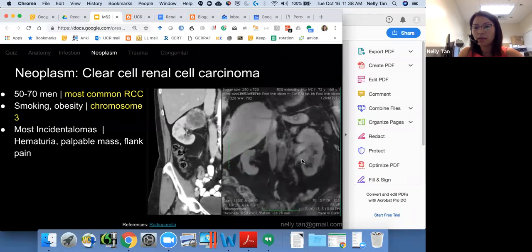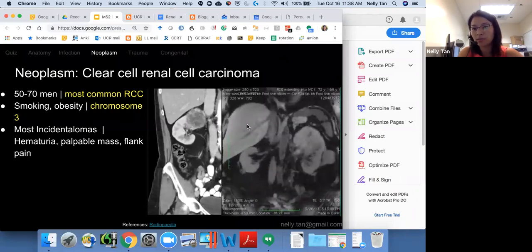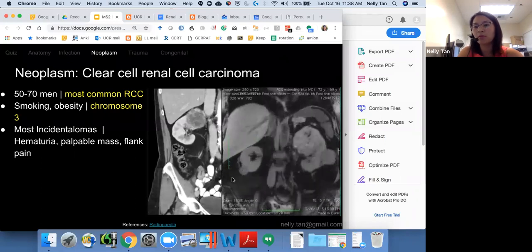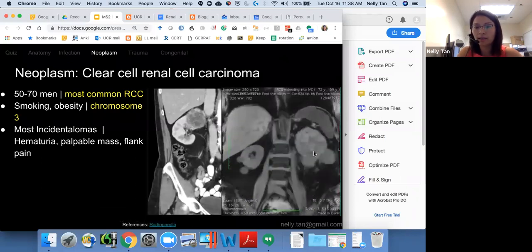This is an MRI, good. So it's an MRI and it has contrast. And we know this because part of the liver is lit up, the kidney is lit up. And which side is abnormal, the right side or the left side? How do you know it's MRI?